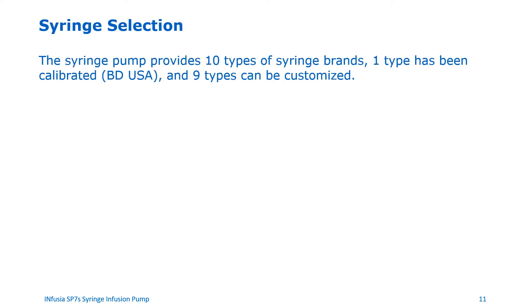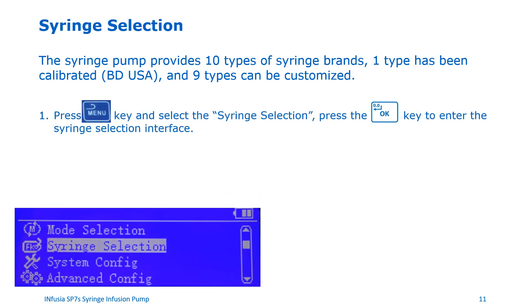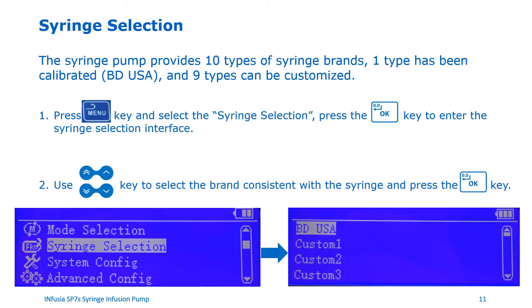Selecting the right syringe from the menu. The pump allows 10 different syringe brands to choose from. The pump is already calibrated for BD USA syringes. The other nine brands can be calibrated quickly with a few key presses. To select the right syringe, press the menu button, then select syringe selection from the menu, and press the OK button to enter the syringe selection interface. Use the up-down arrows to choose the brand of your syringe and then press OK. If your brand is not listed, choose one of the custom options and proceed to calibrate the syringe.